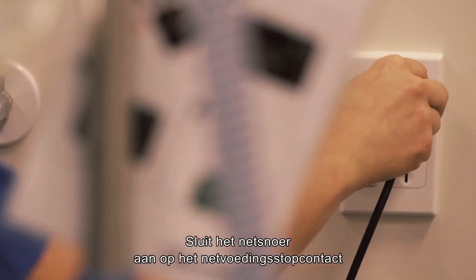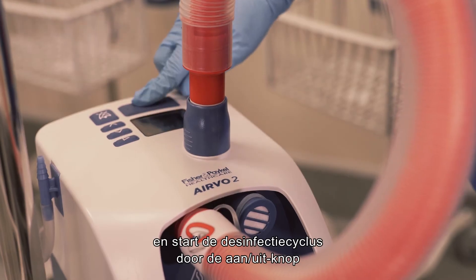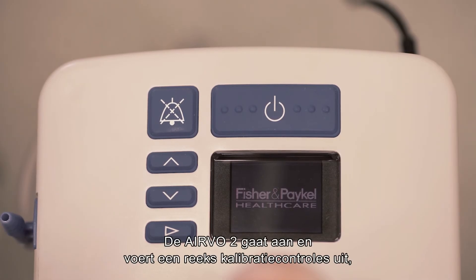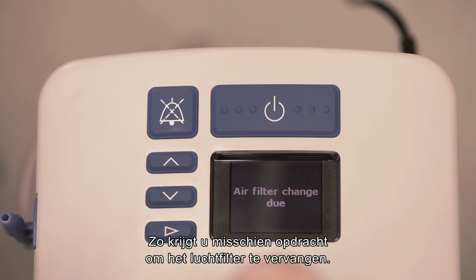Connect the power cable to the mains utility power socket and start the disinfection cycle by holding the on-off button for three seconds until the unit beeps. The AIRVO 2 will turn on and run a series of calibration checks, raising an alarm if any problems are detected. For example, you may be prompted to change the air filter.